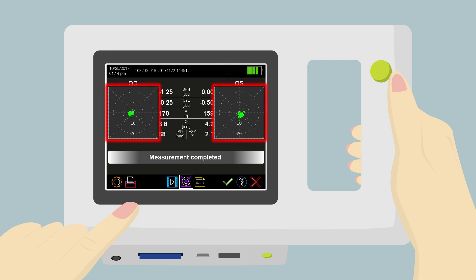The left and right side of the screen show the gaze charts which indicate the viewing direction of the child. Do not be alarmed if red dots show on the chart. It simply means the child was not looking directly at Smiley's nose at the instant that particular infrared photograph was taken.